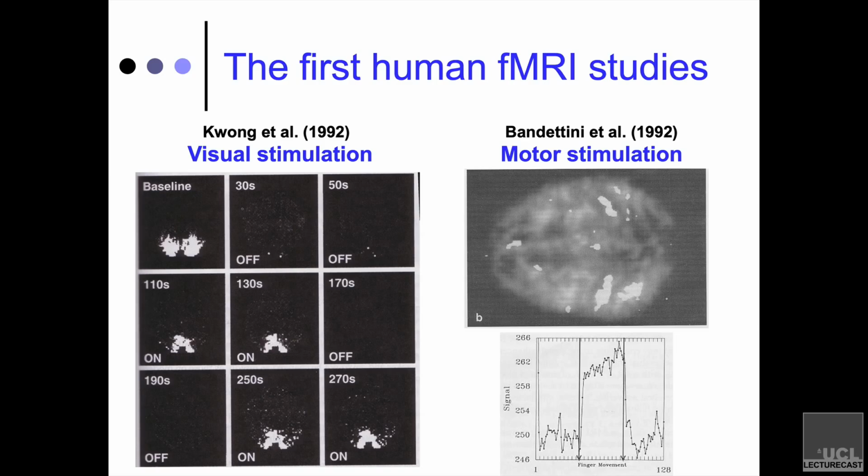So what Peter's group did was they had an experiment where people were lying in the scanner and they would get tapped on their leg, and as soon as they did, they had to tap their fingers like this, right? It's not particularly complicated, but all of a sudden you're using motor cortex. And then they would tap them on the legs and they would stop. So what would happen was, if you look in motor cortex, so this area here in this image, you can see that when they're not tapping, activity is relatively low. And as soon as they start tapping, activity increases.